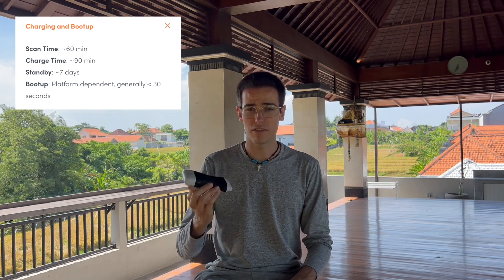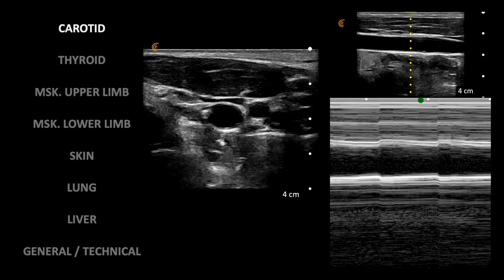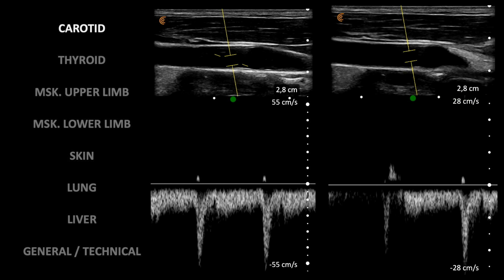Boot up time in my case was 30 seconds. Now that we've seen both the inside and outside, let's see the most awaited part of the review — real life images acquired on a daily basis by a normal user like myself. We'll start with some carotid images: neck transverse section on the left, and M-mode of carotid linear section on the right — note the pulsatility. And this is a pulse wave Doppler mode at the carotid bifurcation level — note the waveform. Same with these two clips from the common carotid artery.